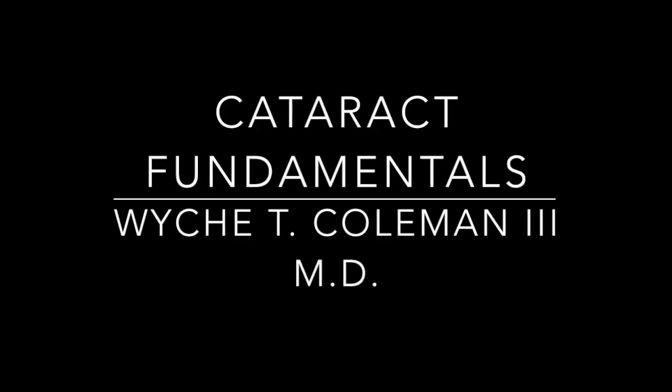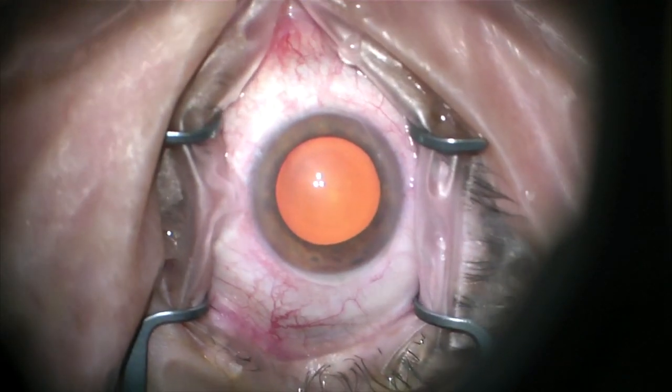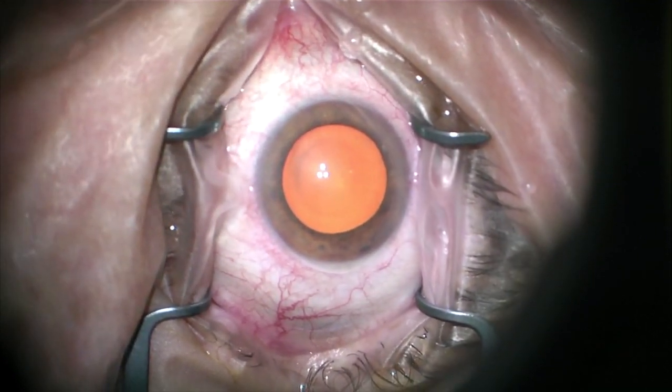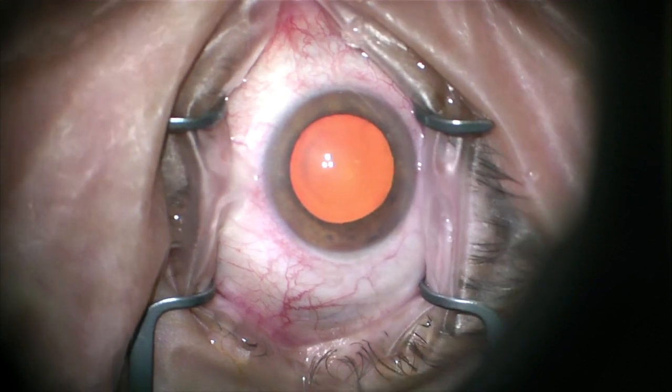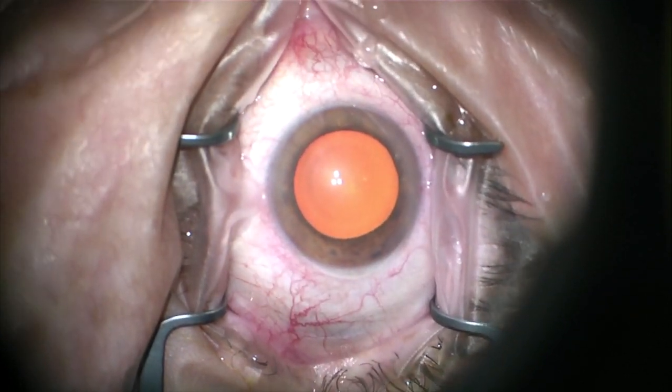Hi everybody, this is Dr. Wyche Coleman. I wanted to make a cataract surgery fundamentals video. I think there's a lot of advanced content on the web, but there's not that many things showing new residents how to do a basic straightforward cataract case. So here we go. I'm going to talk through this one. I've learned a lot from a lot of people and I'm going to try to give credit where credit is due.